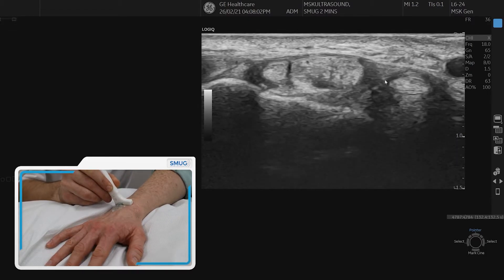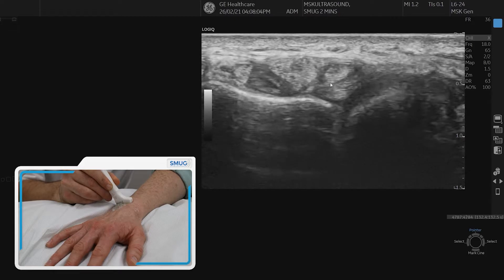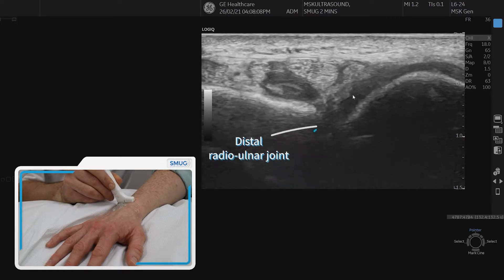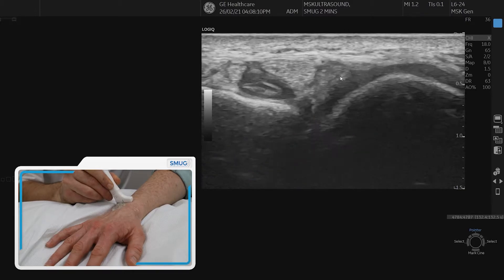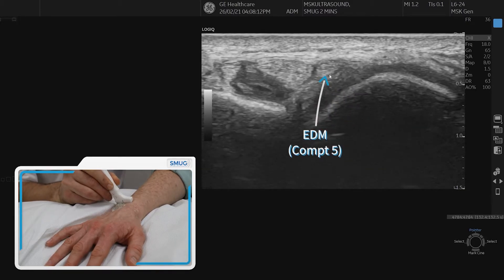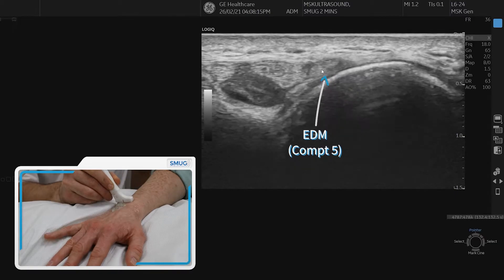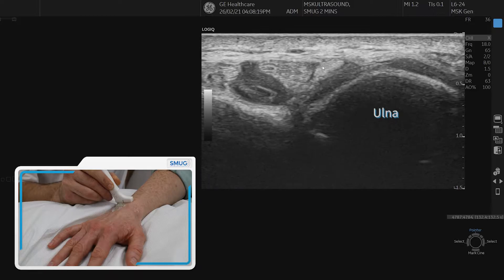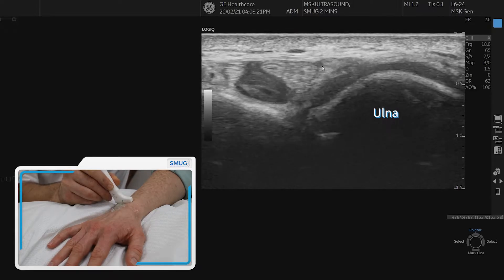If we go to the next landmark, which is the distal radio-ulnar joint, you'll see a little tendon on top of that which is the little finger. You can always just get your patient to move to assess that — that's compartment five, which is extensor digiti minimi.